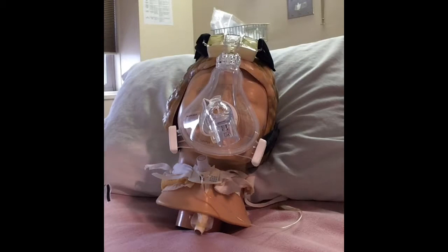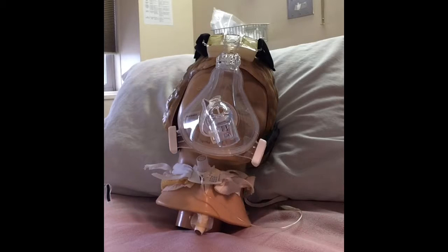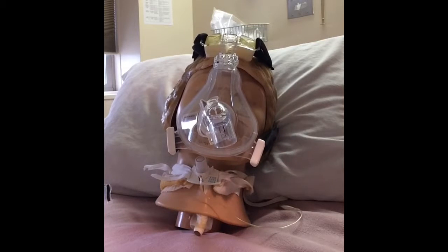Once I think I've achieved a good seal, I'll look at my machine and see where my leak is at. The optimal leak is 10 to 30. If you have a leak of 0, it's too tight. Start loosening these up a little bit. Skin will break down really fast if you have a leak of 0.